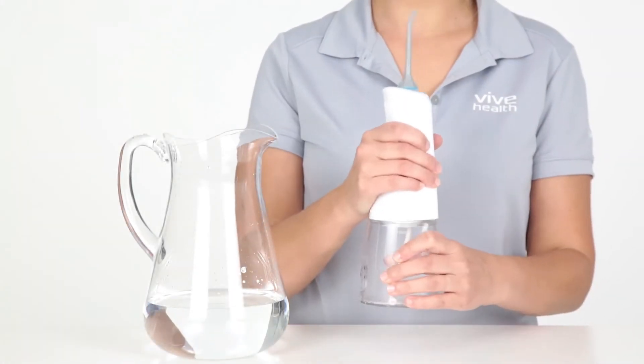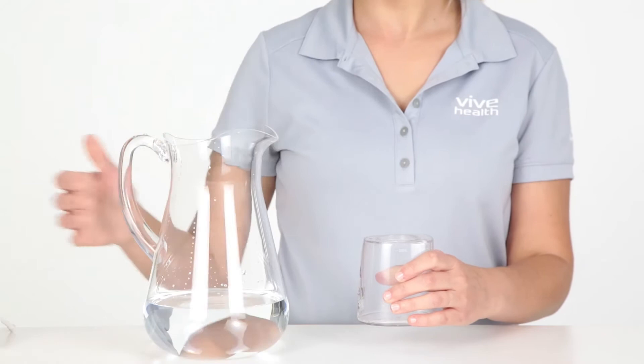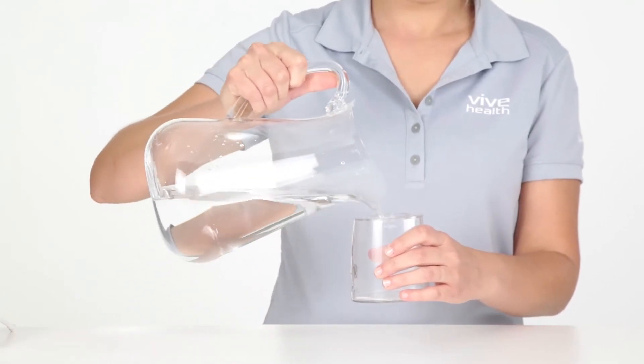Open the water reservoir lid and fill with water. Turn off the device when filling the water reservoir.